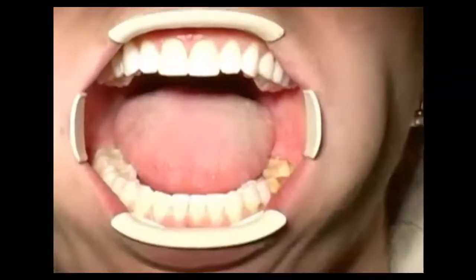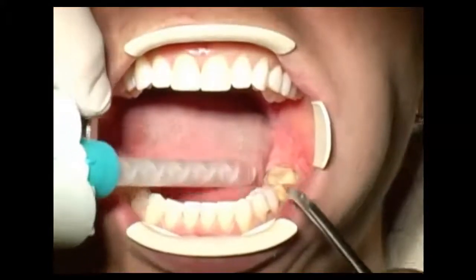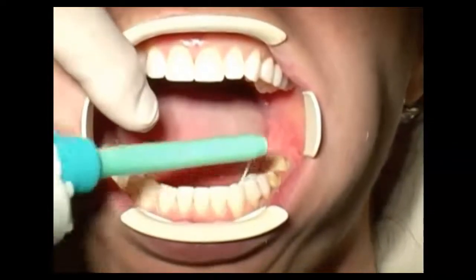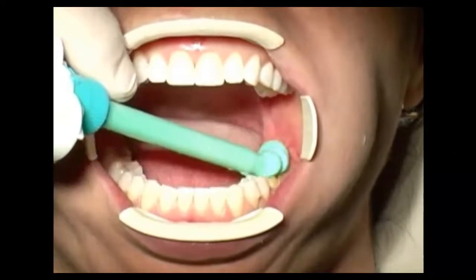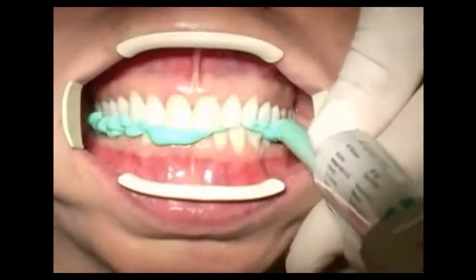So that shows you the final impression. They're going to do another bite registration with the teeth prepped. And this time they're doing a full arch bite registration.